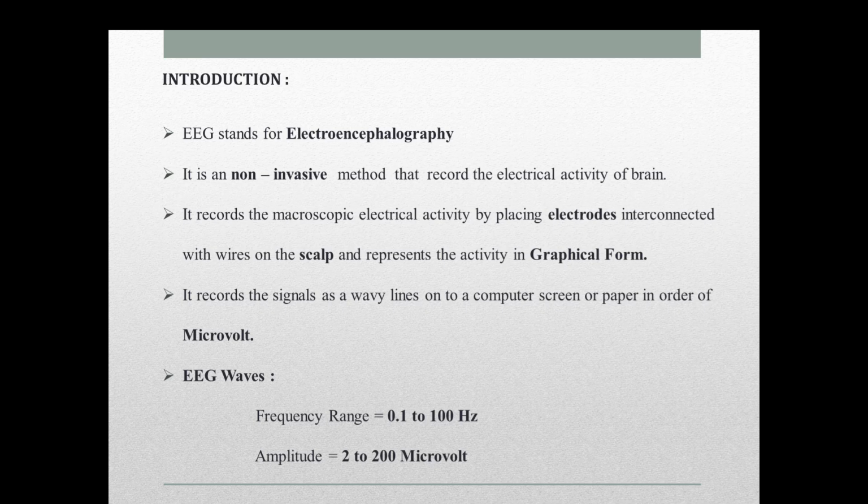It is a non-invasive method. Non-invasive means it does not involve introducing any instruments inside the body. It is not introduced into our skin, and it records the electrical activity of the brain. It is painless, and the activity is recorded by placing electrodes on the scalp, which are interconnected and together represent the electrical activity in graphical form, as wavy lines. The output is in two forms: one on the computer screen and the other on paper.